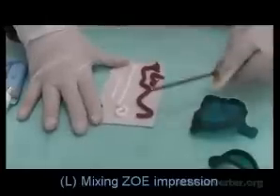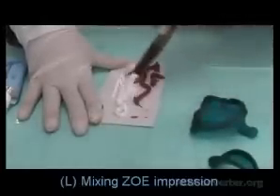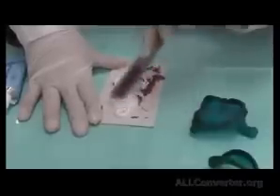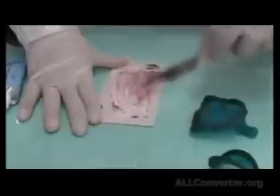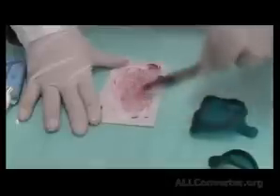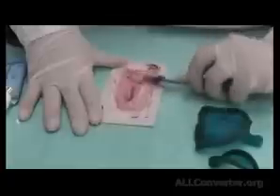So once the material is extruded, we try to gather the material together. Joining the two plates, we begin mixing until the material becomes uniform in color. We could first mix them, and then we begin squeezing them towards the pad.